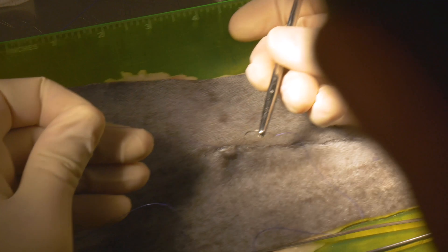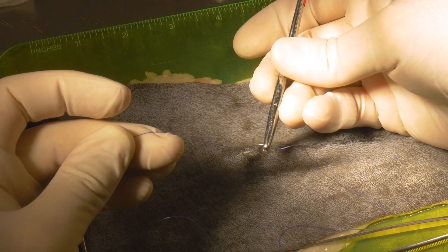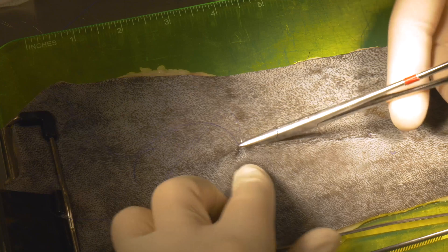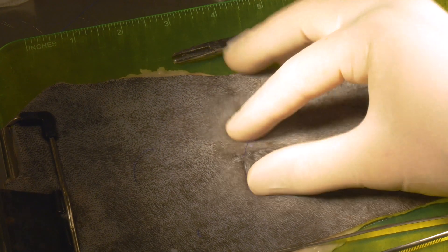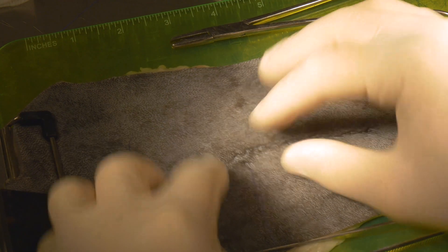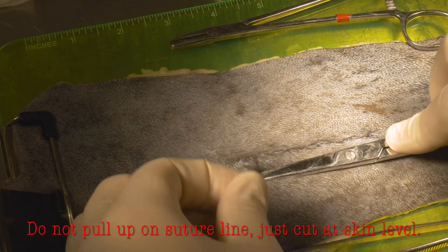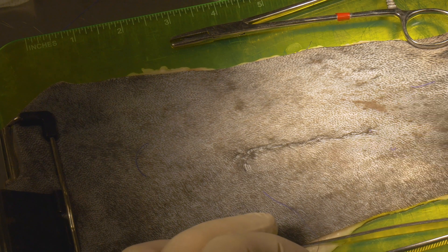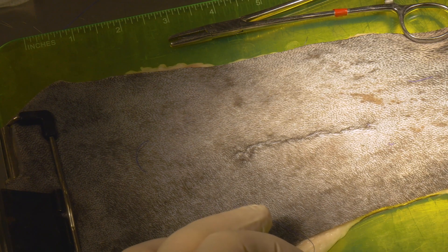Push down on the skin so you can see your needle and your knot. Find that sweet spot, and once you can't see your knot anymore, when you cut this, do not pull up on it — just leave it down and cut it next to the skin. You actually want the tag to be a little longer, because the way it locked into place was by going through that last loop. Leaving a slightly longer tag will ensure it doesn't find its way back through that loop and it won't untie.